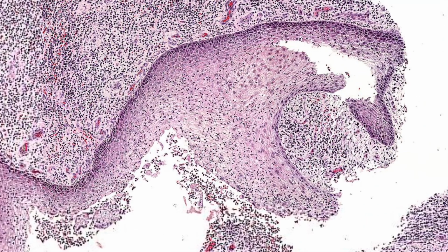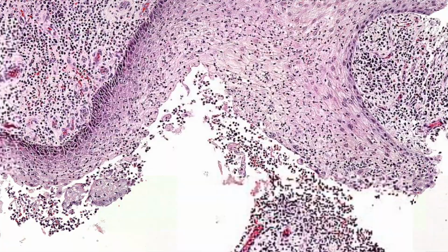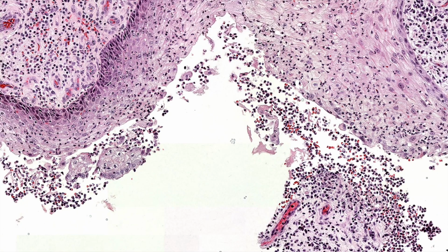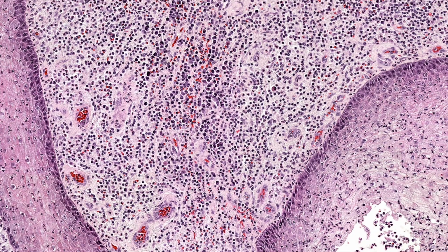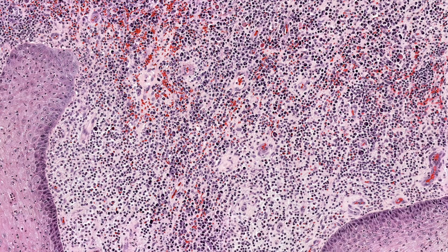I'm still struggling to see cell types, but it does look like a dirty inflammatory mix. Neutrophils, yeah. A little of everything, right? Neutrophils, lymphs, plasma cells, often eosinophils, red cell extravasation, all of it. Throw it all together. It's the kitchen sink.